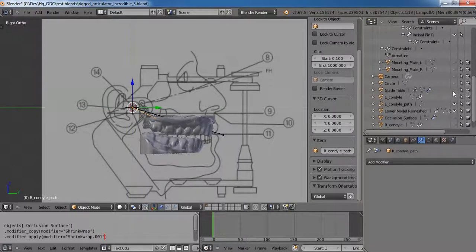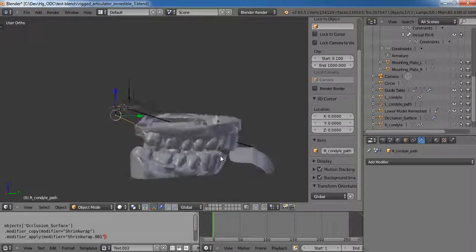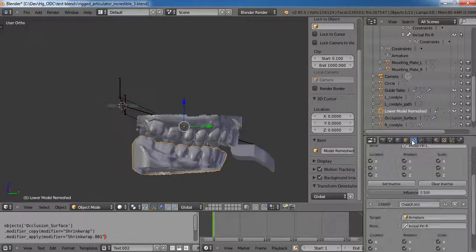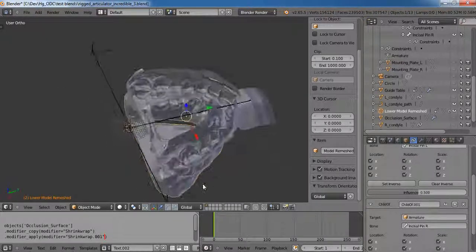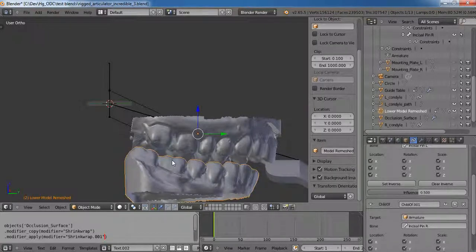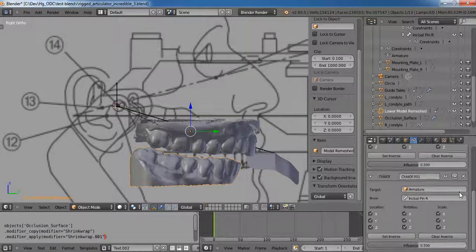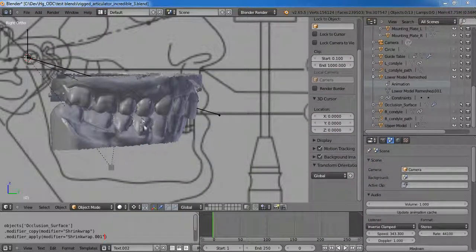And then I have a custom guide table, which for now is just something that I made on my own, but in the future could be a 3D scan of pretty much anything. So one problem I have here is my pin. I haven't dropped my pin. I'm not exactly sure the best way to do that for right now. Let me pause this and then come right back. Okay, so I dropped the pin, so to speak. That's something I'll definitely have to work on.